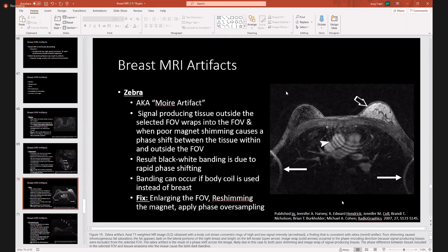This image demonstrates all the most common MRI artifacts. The zebra or moiré artifact is here in the middle, denoted by the arrowhead. With the other arrow, you see the wraparound artifact. The open arrow shows incomplete fat saturation. You can actually see some motion on this as well.